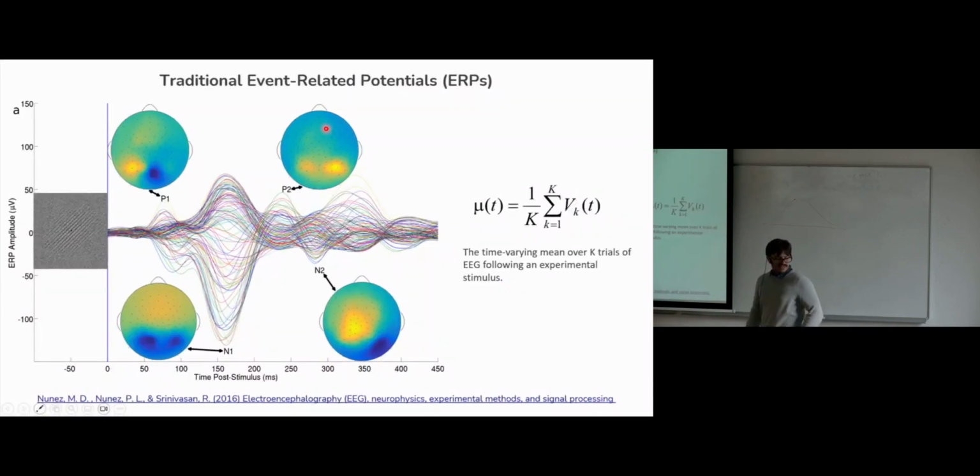If I think about this data as a matrix where time is my rows and the columns are electrode space, and I do principal component analysis on that matrix, I get a decomposition with components as my columns and time as my rows. I take the component with the highest amount of variance, the first component, and what I have now is a weight over channels that gives me that first component.